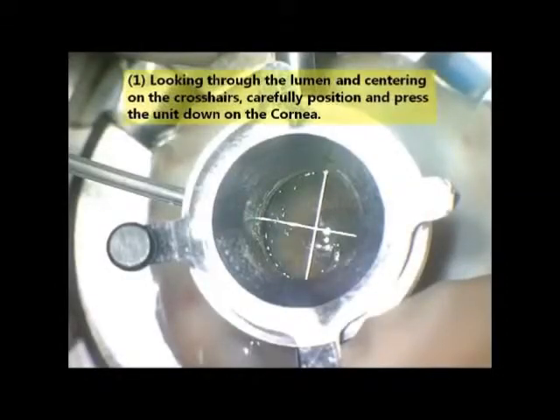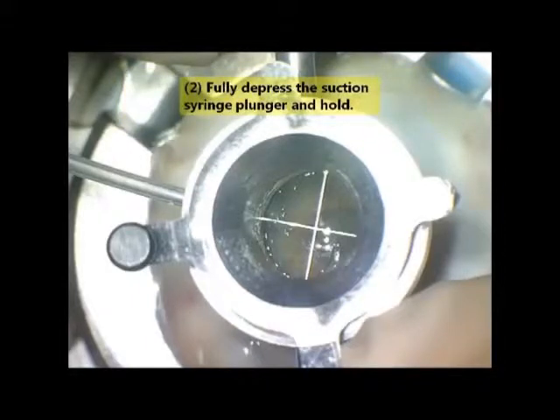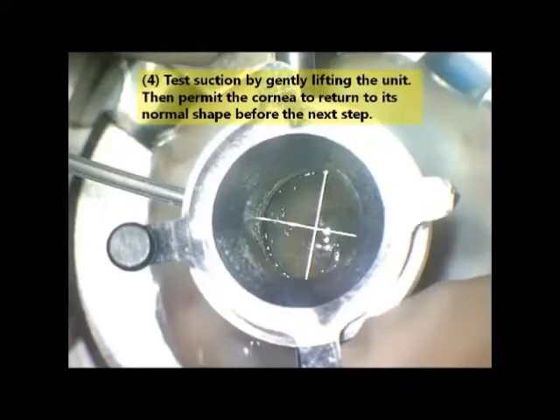To achieve vacuum, position and press the unit down on the cornea. Depress the plunger and hold. Release the plunger and wait 10 seconds. Test suction and allow the cornea to return to normal shape.